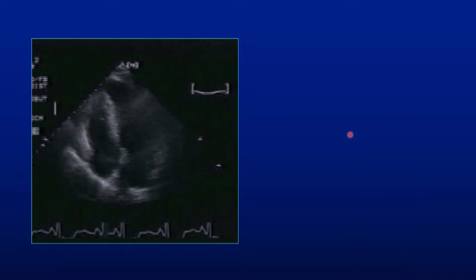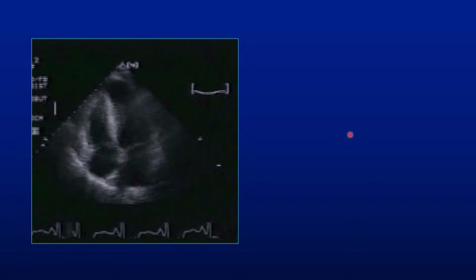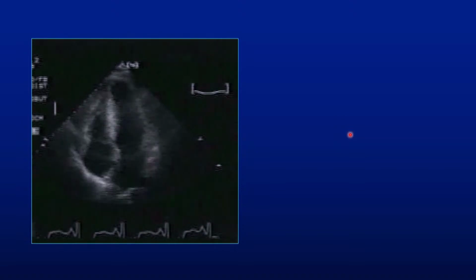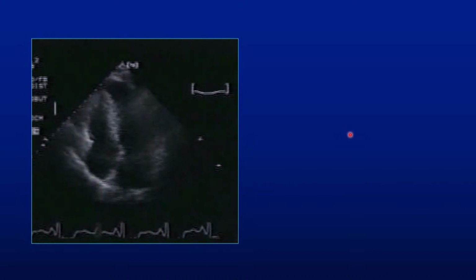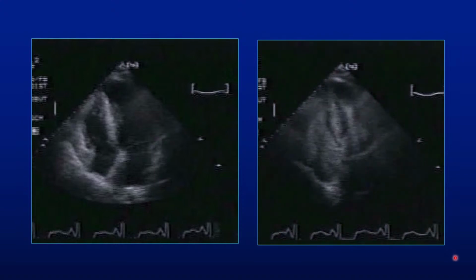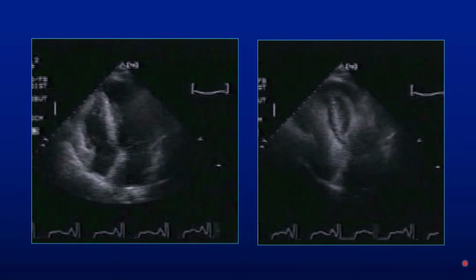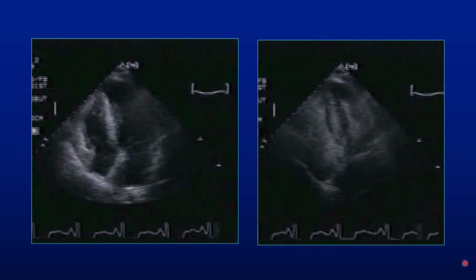Take a look. This is a case, and I want you to tell me something about it. Ventricular function, is that good? Yes? Looks probably good, I'm guessing. I don't see the endocardium. I see the descent of the base. For those of you who pioneer descent of the base, it's good. This is this case. Same patient, hypertrophic cardiomyopathy, with a good ventricle.